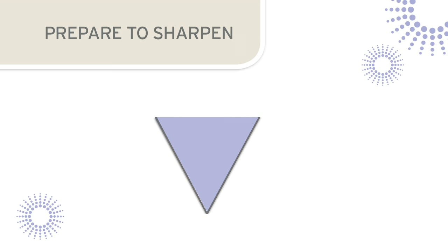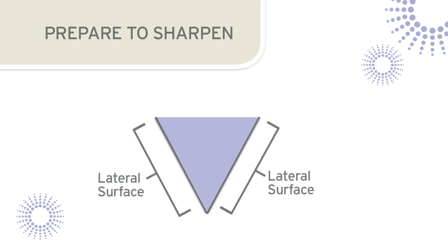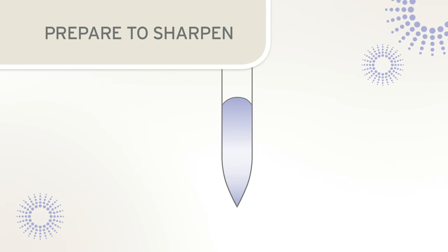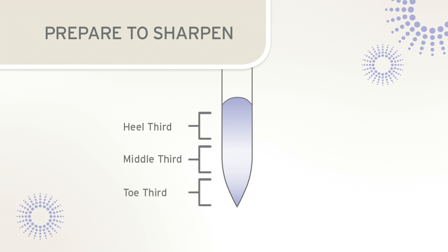During sharpening, the cutting edges will be restored by grinding against the lateral surfaces of the blade. It is not recommended that the facial surface be sharpened as this can weaken the blade. When sharpening a sickle scaler, the entire length of the blade should be sharpened, including the heel, middle, and toe of the blade. When sharpening, the stone will be moved along the blade edge from the heel to the middle and finally to the toe of the blade.